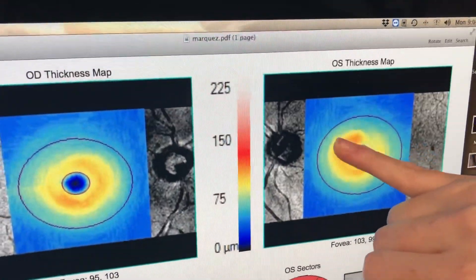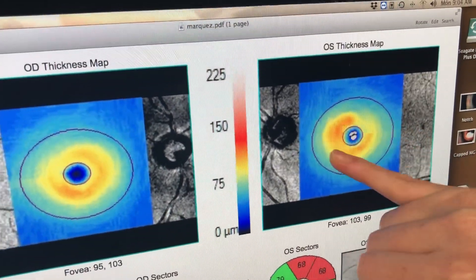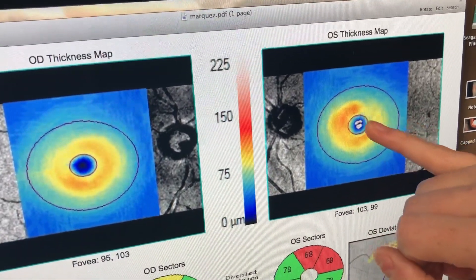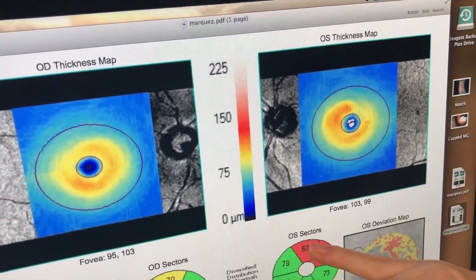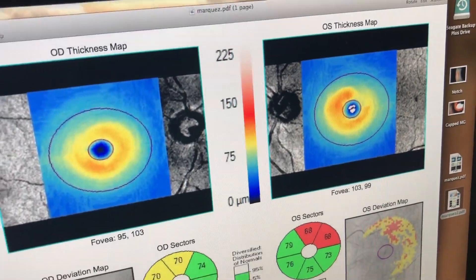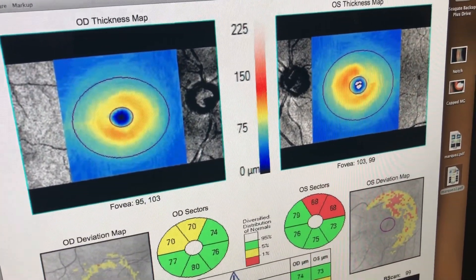Up here I'm looking at my donut — I should have a nice round donut, but someone's taken a chunk out of that, which correlates here. If I do a visual field, you'll see inferior nasal dropouts.